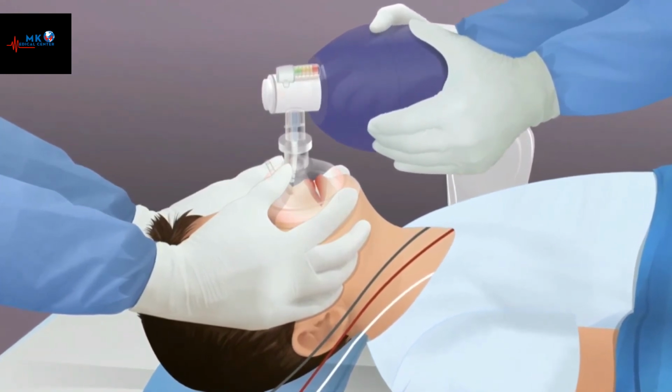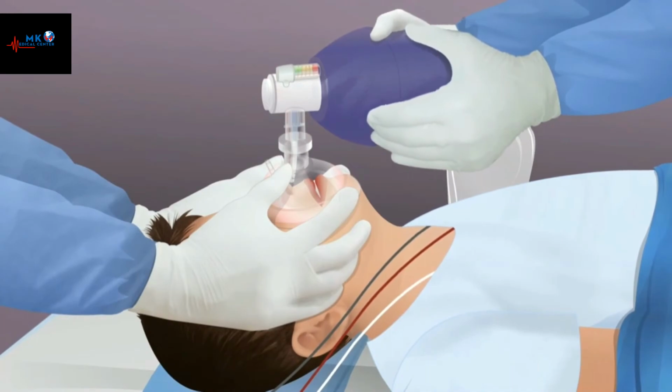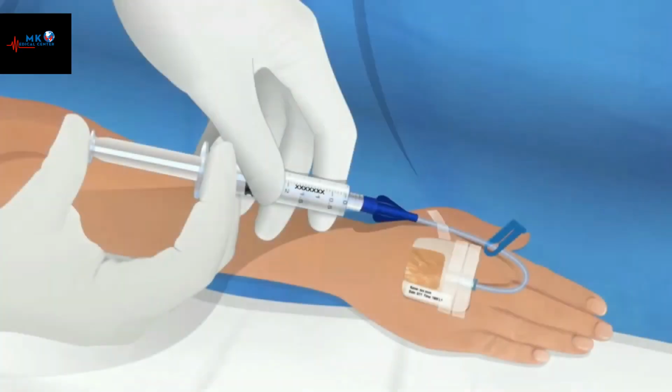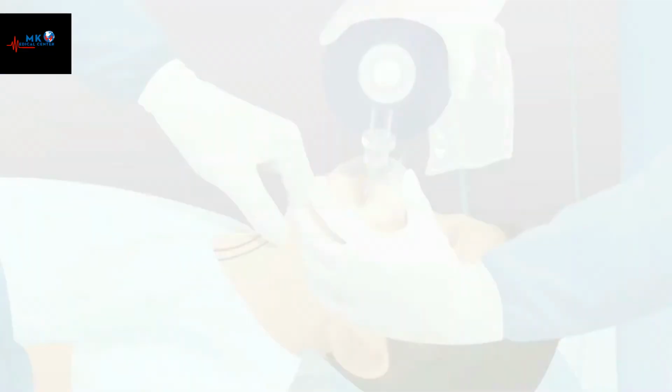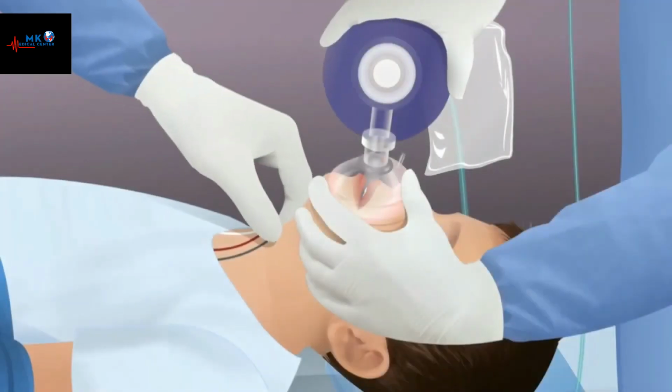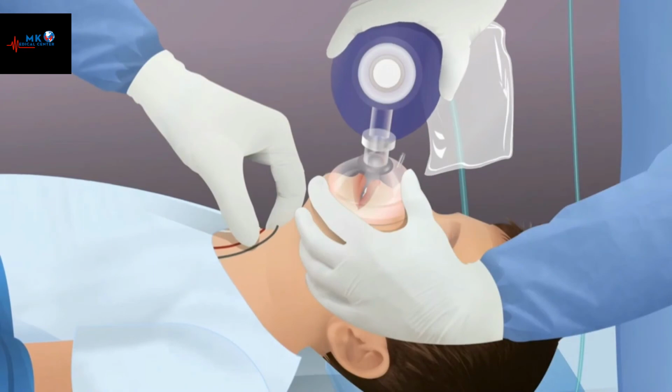Continue using the bag mask device to assist with pre-oxygenation. Administer intubation medications as prescribed. Apply cricoid pressure, Sellick maneuver, if directed by the practitioner.